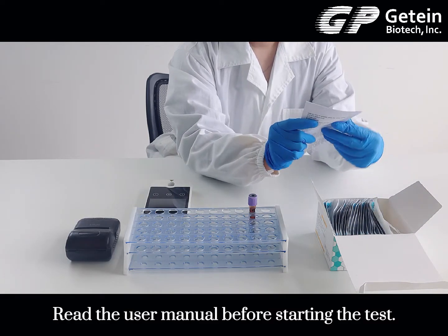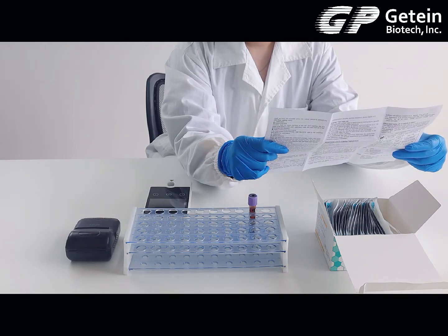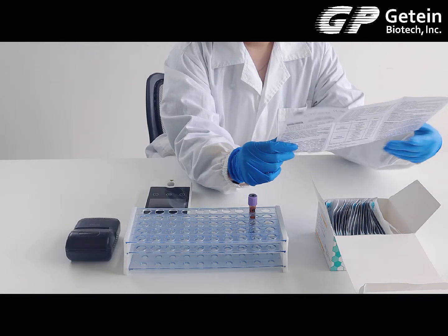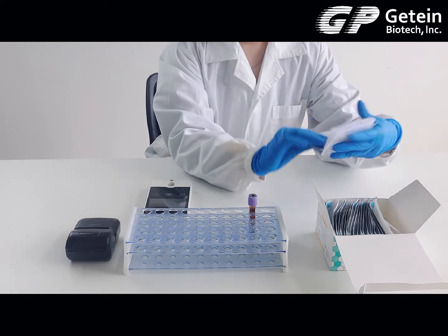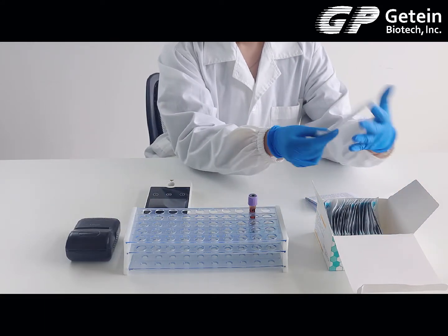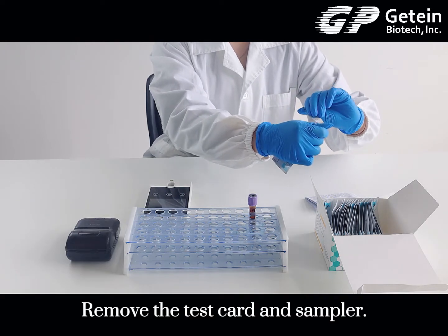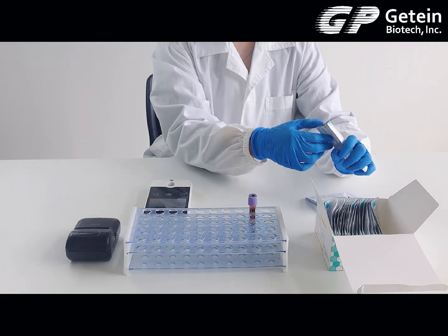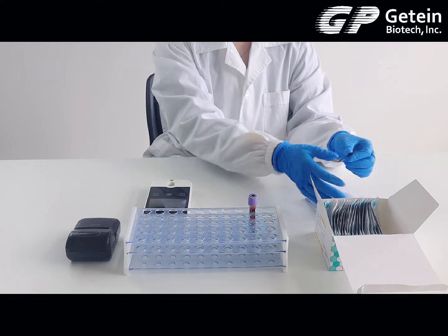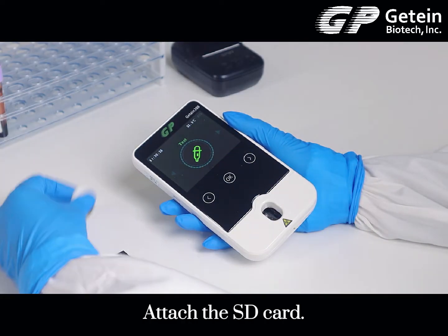Read the user manual before starting the test. Remove the test card and sampler, and place them on the table horizontally for further use. Then attach the SD card.